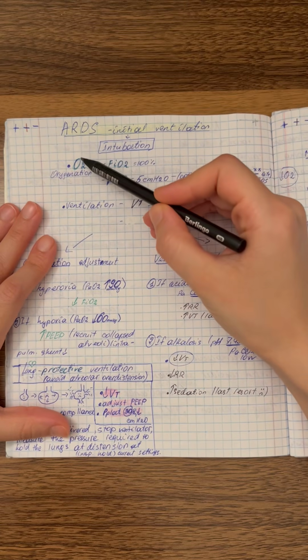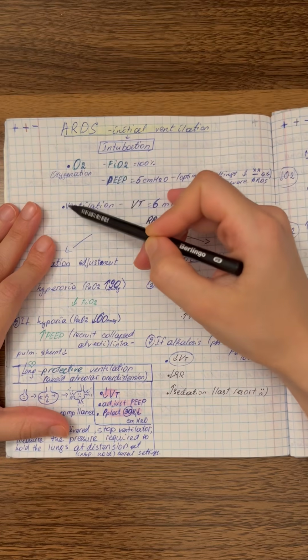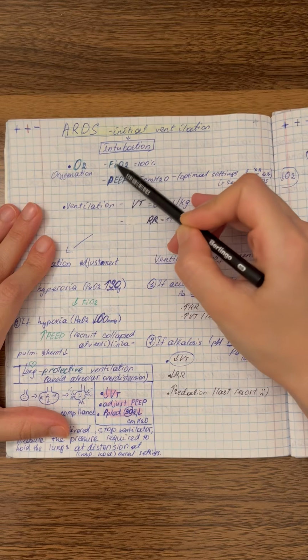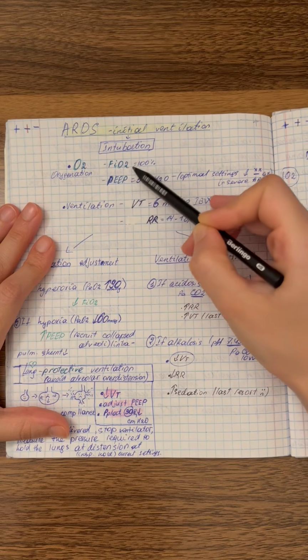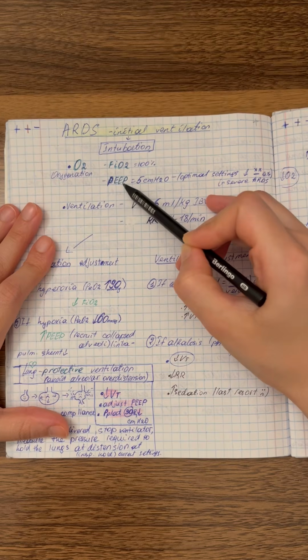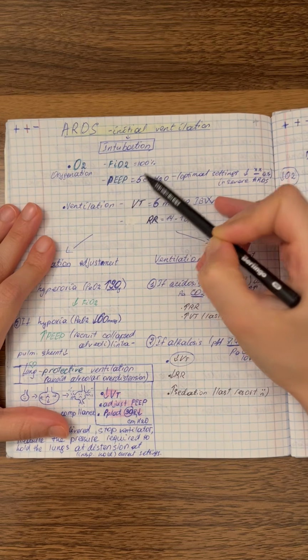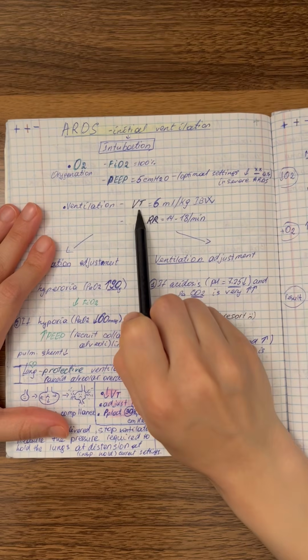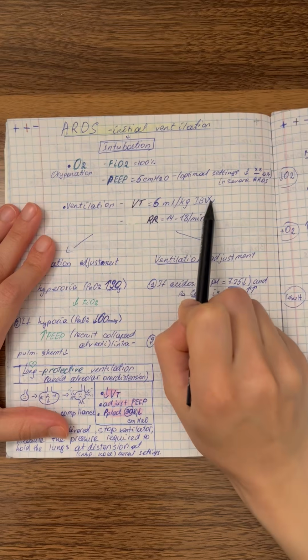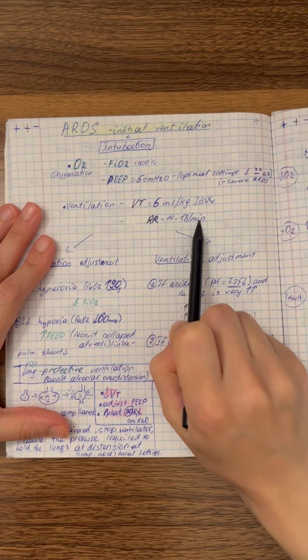The two important components of the ventilator are oxygenation and ventilation. Oxygenation is done with the help of the FiO2, or fraction of inspired oxygen, which should be 100%, and PEEP, or positive end expiratory pressure, which should be 5 cm H2O. And ventilation is determined by VT, or tidal volume, which should be 6 milliliters per kilogram ideal body weight, and respiratory rate, which should be 14 to 18 per minute.